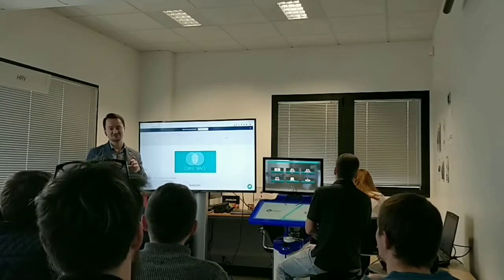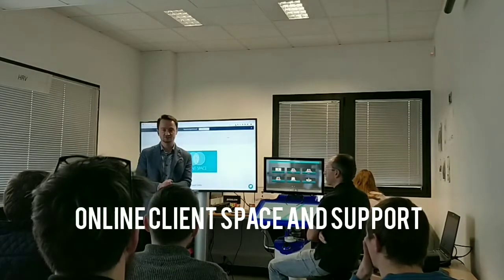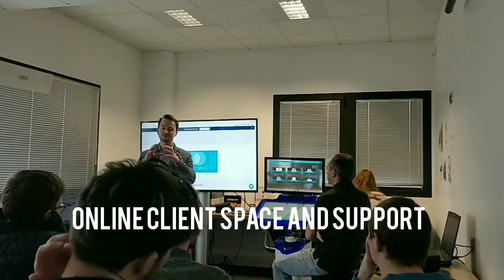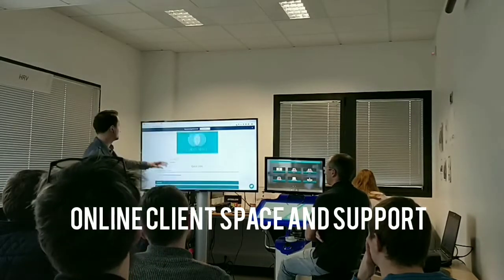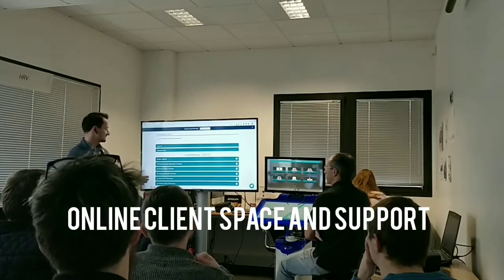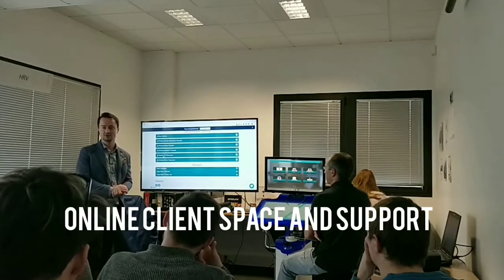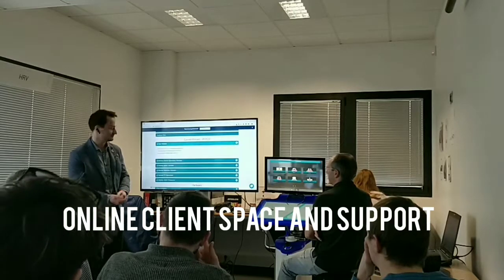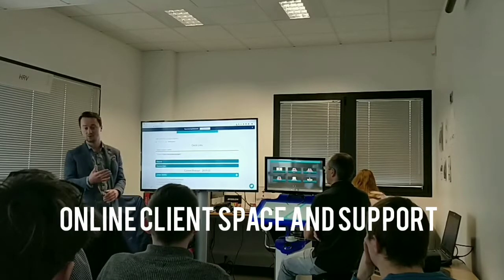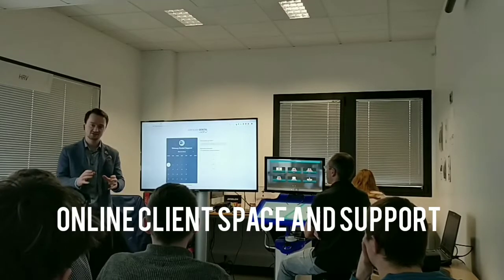Often one of the questions is, after we leave university, after the training, after the installation, how do we provide support? And the answer to that is we've put a space online for clients here at virteasy.com/client, where the universities have access to all the user guides, extra material, STLs to download to create even better exercises. And up at the top, we have a link to virteasy.com/support for our clients, which provides access to a calendar of all our team.